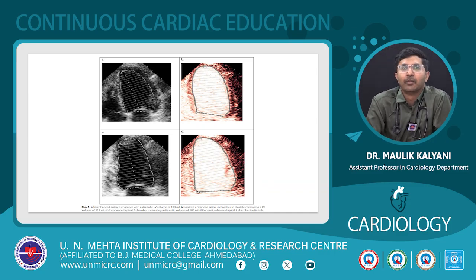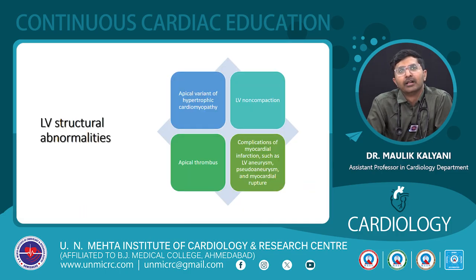This study shows the same when we don't have the true endocardial border, compared to the right side, where we can completely take the image with the bubble contrast and apply the Simpson method, which is comparable to cardiac MRI when there is complete delineation.